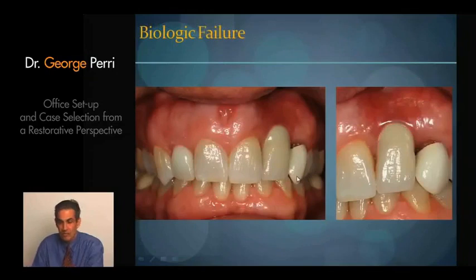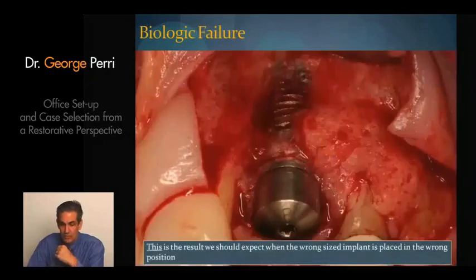One thing that often leads to restorative and surgical failure is a failure to treatment plan the whole patient. We need to look at the whole patient and make a decision. Should we remove that deciduous canine? And in this case, I think that was a definite. We do have that opportunity now, though, that we could remove it. When we look at the surgical retreatment, though, we realize what a challenge these cases are to retreat.